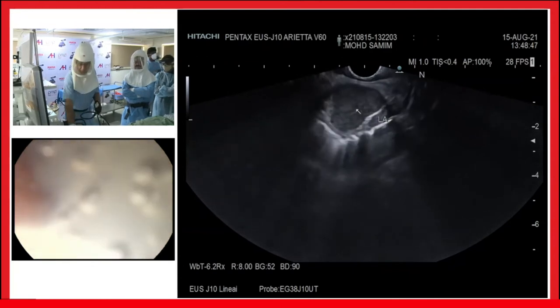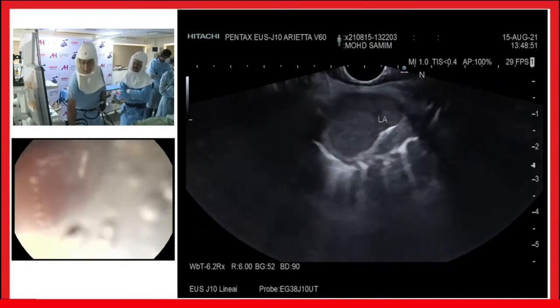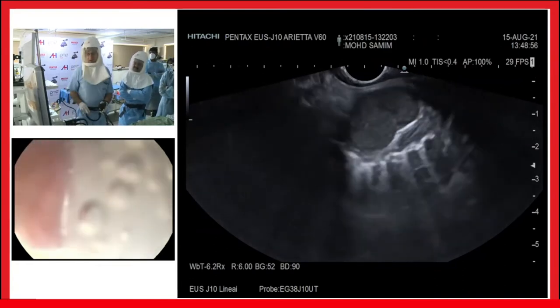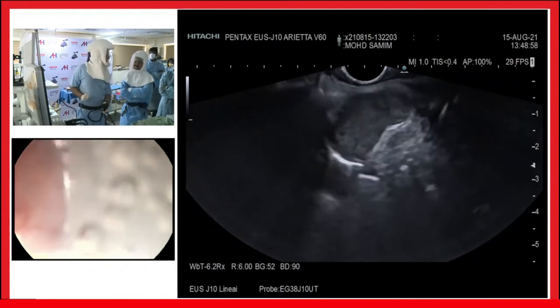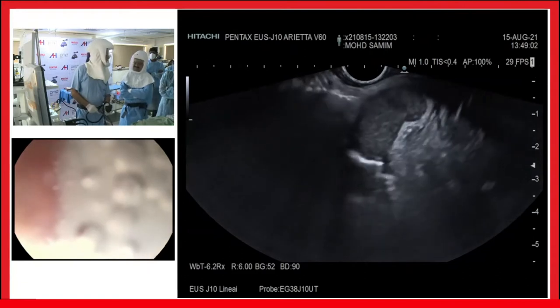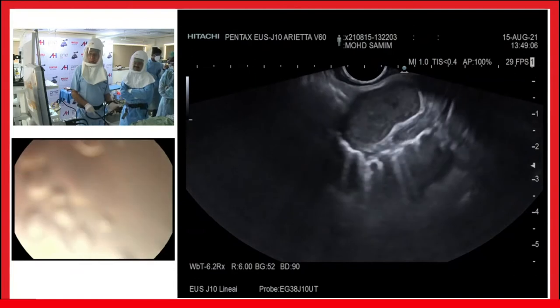So then I would say that this is a tumor embolus, or is it from a thrombus? Okay, I cannot do FNAC from the mass, but I can do an FNAC from this tumor embolus. So that is the second option I have. So Dr. Tinku, why don't we take it?